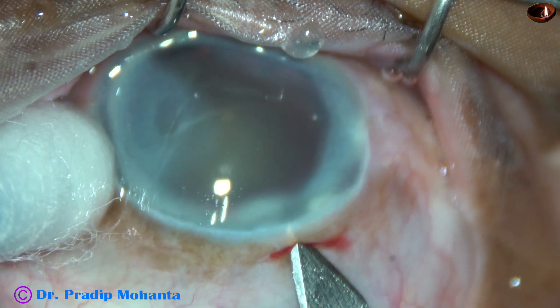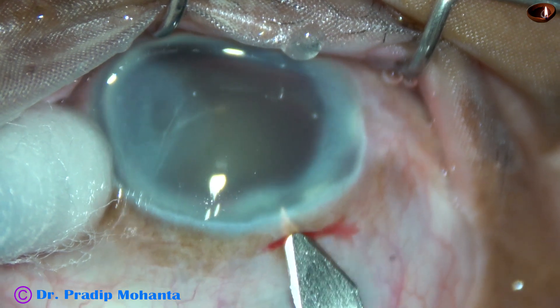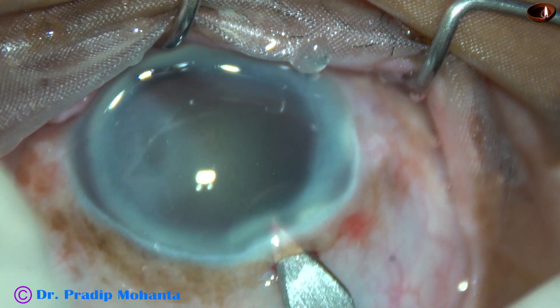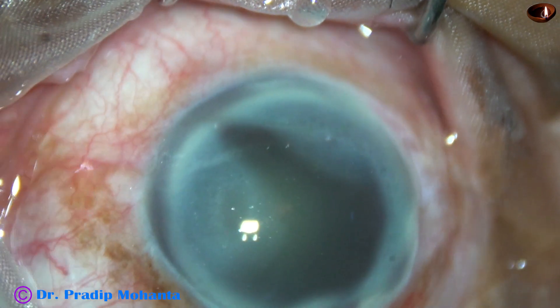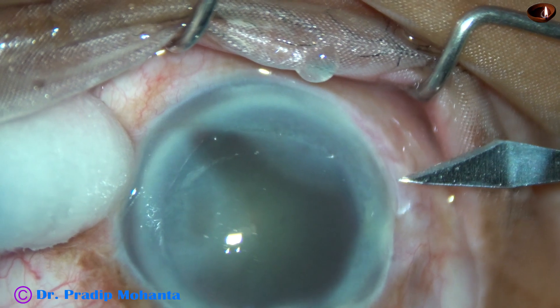Now watch the incision. A vertical groove just posterior to the limbus on the sclera, and then advancing horizontally for a distance and then going downwards to enter into the anterior chamber. This is a 2.8 mm incision with a steel keratome.